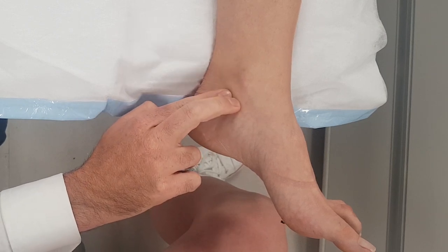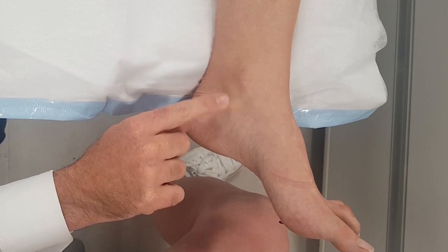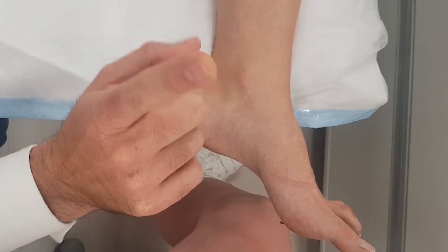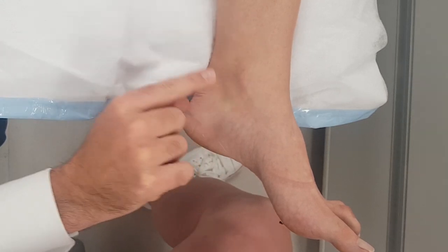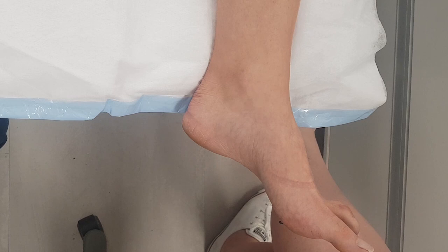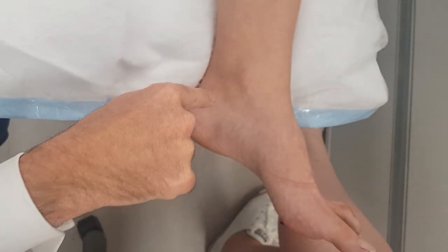With Hannah, it's probably going to be very easy just to palpate her tibial artery, and the nerve runs right next to the artery. So once you've located the artery, that's it. But we'll use a Doppler just to prove it, and then we're going to inject in the area where it's the most bounding. Once we've found the artery, I use the end of the Doppler just to mark it.